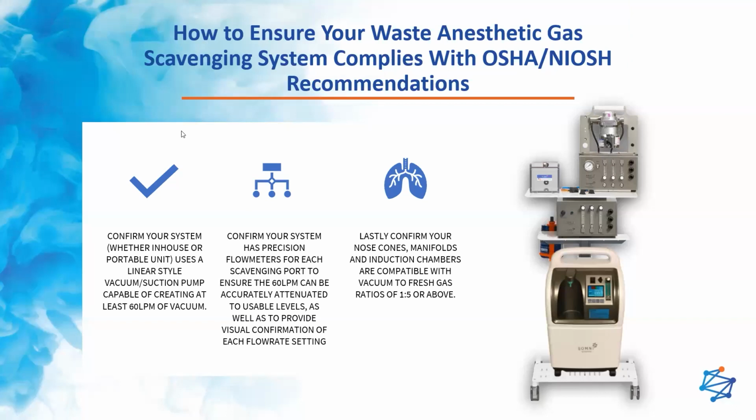Yeah, thank you, Andrew. So it was a great review of just the system itself, as well as the Penta and Decaflow. So recapping on ways to ensure your waste anesthetic gas scavenging system can help reduce exposure. First, we want to confirm that the evac system, whether that's in-house or portable, uses a linear style vacuum.